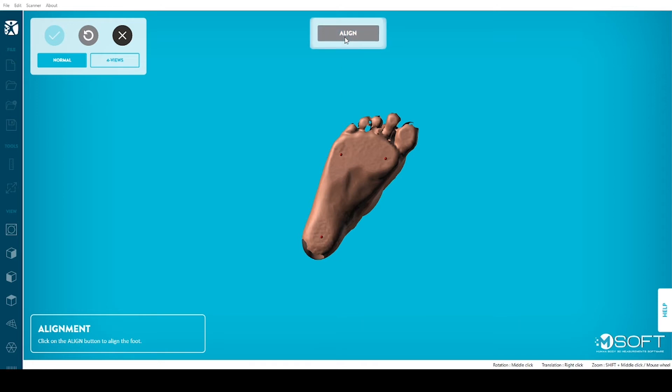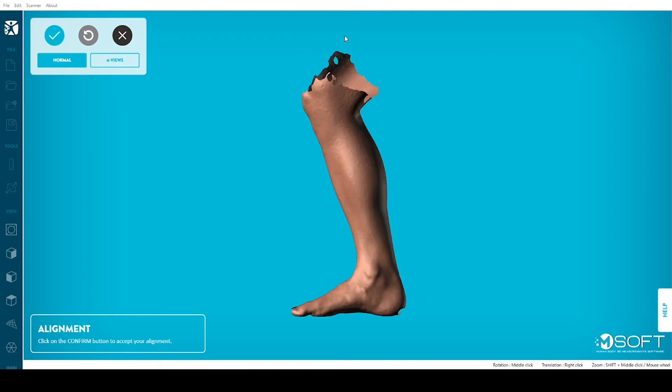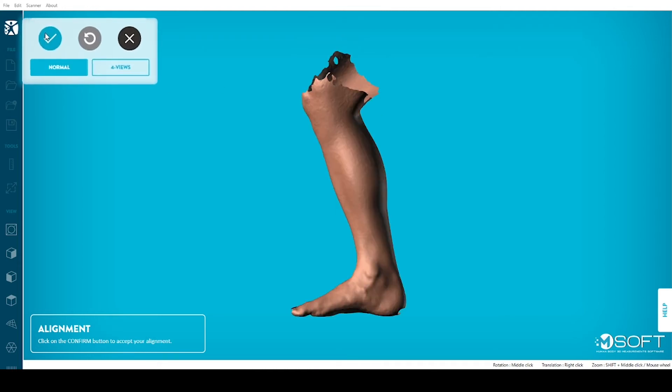When you are done, click on Align at the top of your screen, then on the blue checkmark at the top left corner of your screen to validate.